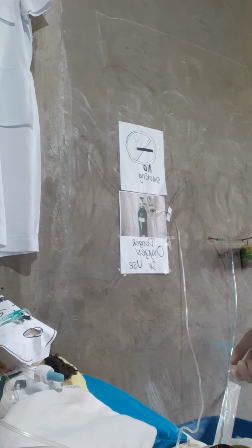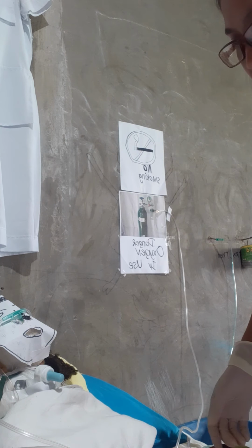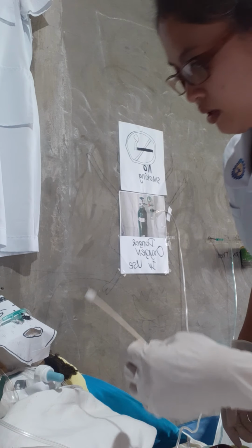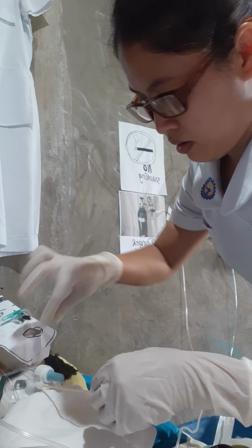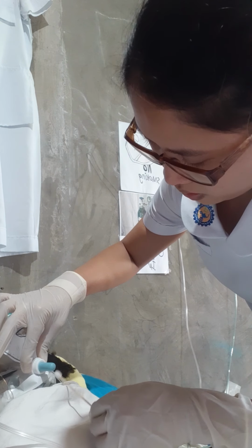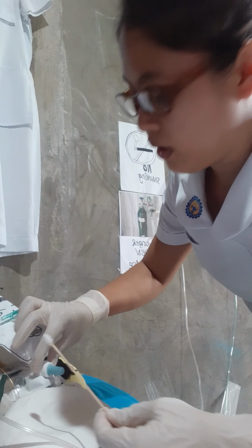Then we need to dip the cotton applicator or gauze sponge in the second basin, and we need to clean the stoma under the base plate. So we can hold this one and we clean it outward.